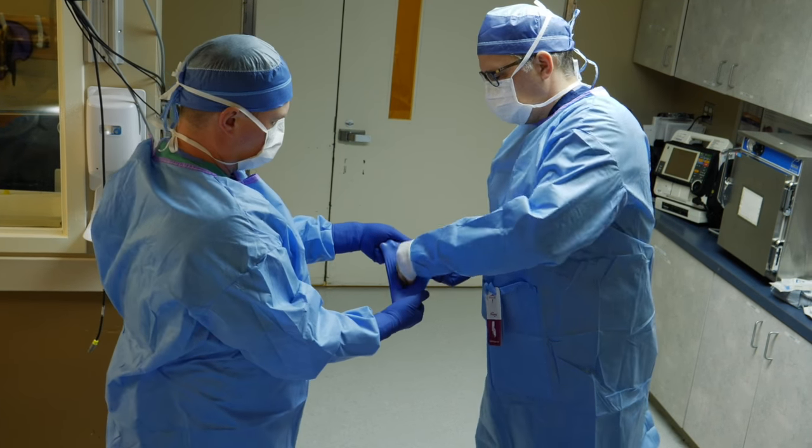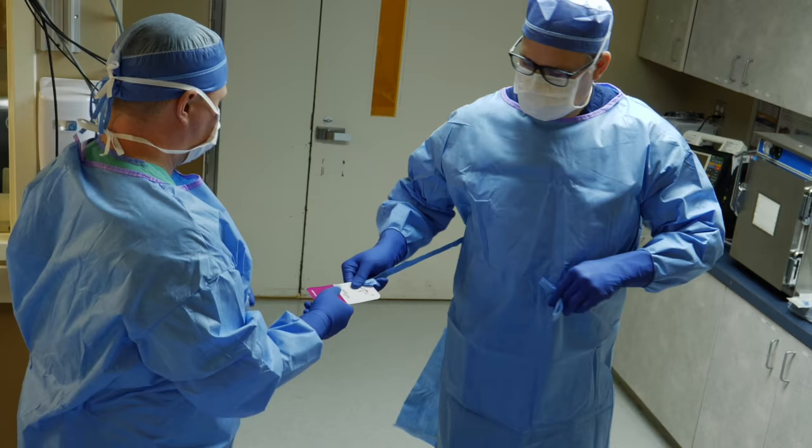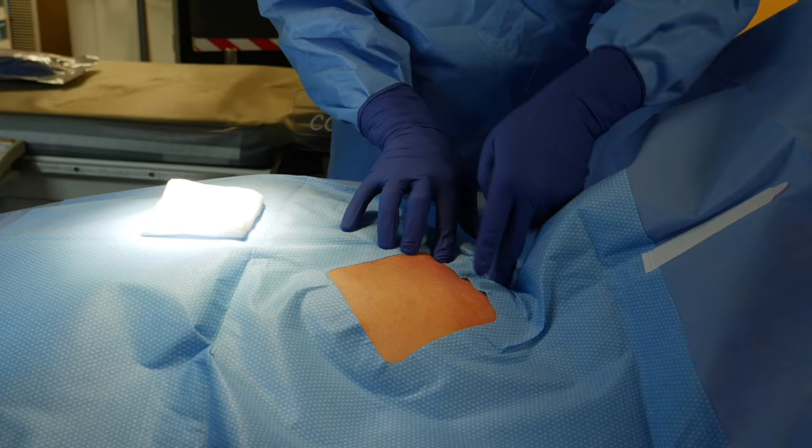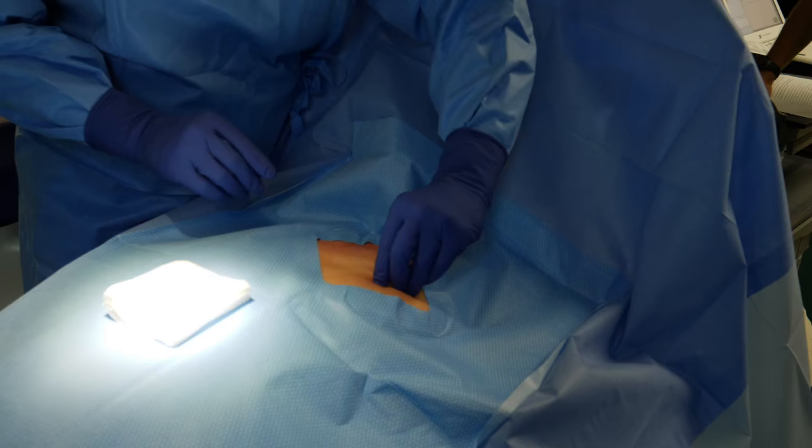Here we're inserting a St. Jude Medical Implantable Loop Recorder for continuous heart rhythm monitoring. We do this under strict sterile technique with sterile gloves and sterile gown. We start by identifying the midline of the patient, position ourselves three rib spaces downwards, four centimeters to the left over the heart, and this is where the loop recorder will be positioned.